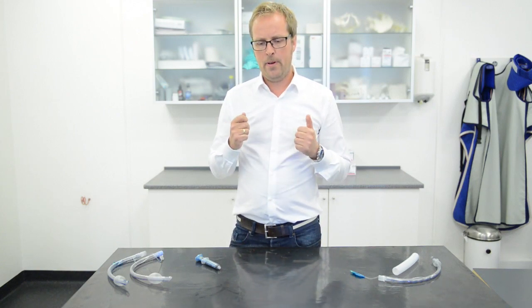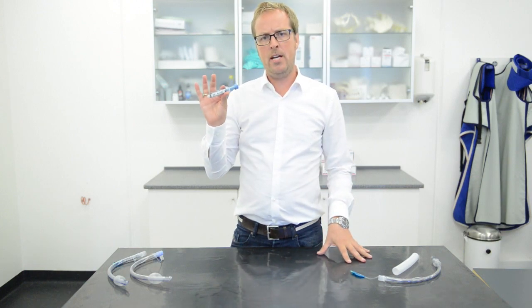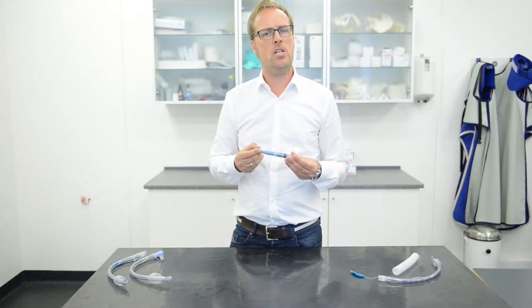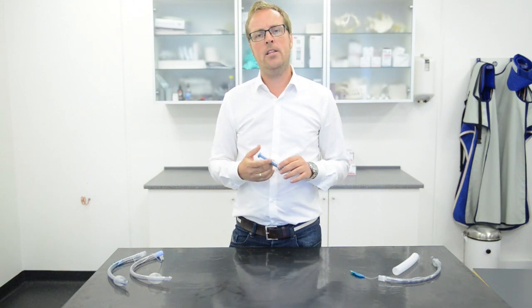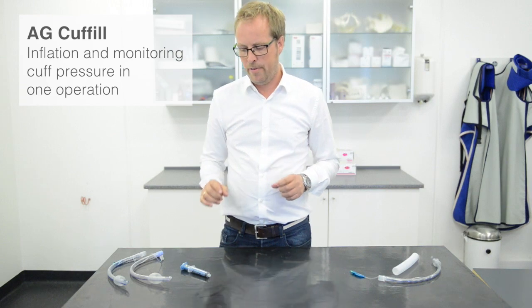So how to avoid this? The good news is we have this little new device. With this one you can in one single movement put in the correct pressure for the cuff.